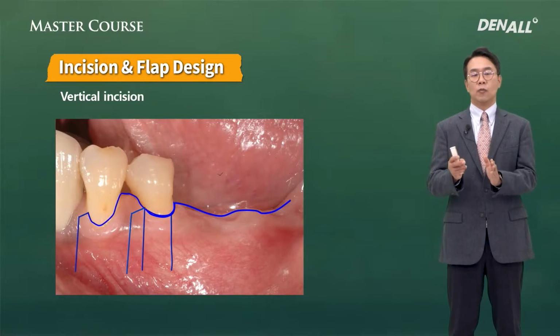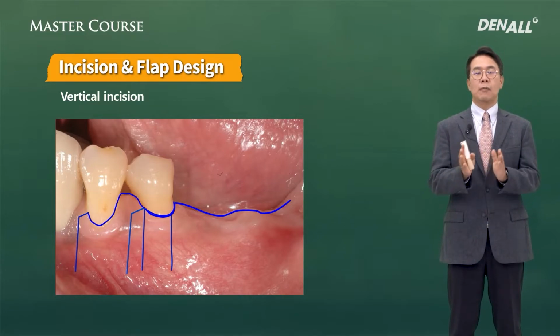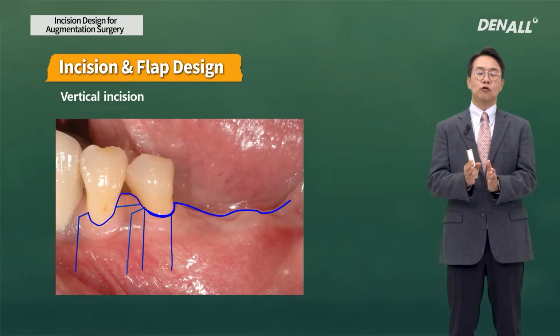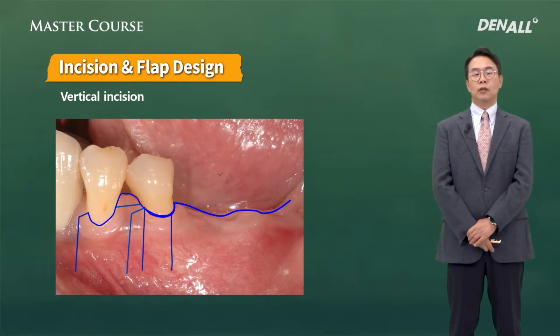Next, interproximal area, all of that can be included up to the tooth right in front of the most posterior tooth. Lastly, it is similar design to the fourth one. The interproximal area is not connected, but it goes horizontally. In the middle, it is more simplified.